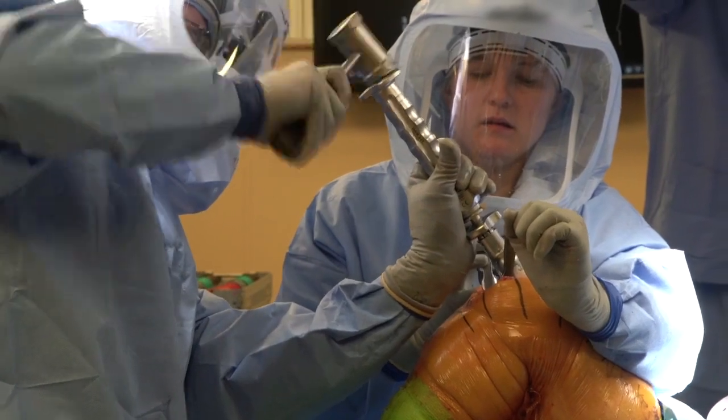This is not a knee that a surgeon should try one time. There are some nuances to it — a cadaver lab is always a great idea — but definitely a surgeon who has done a few hundred of these knees could easily show the aha moments to a new surgeon. There are some tips and tricks along the way that make it slightly different than a PS knee. People say it's finicky or hard to put in, but I wouldn't say that. It's a little different in how you feel when you put it in.